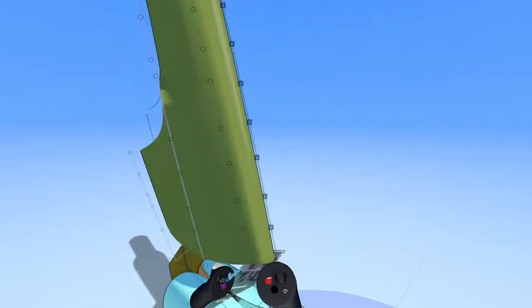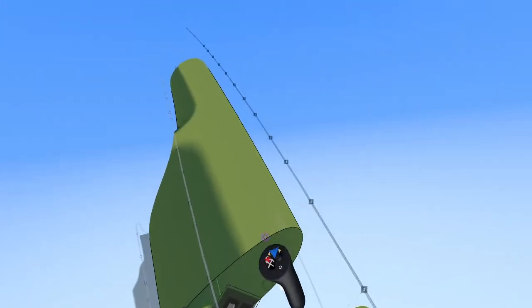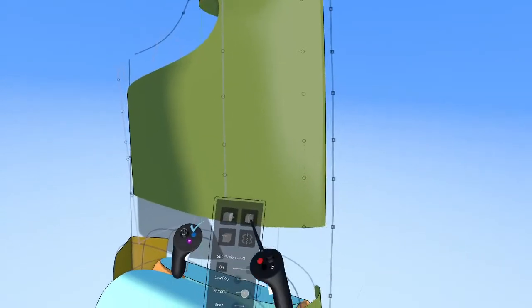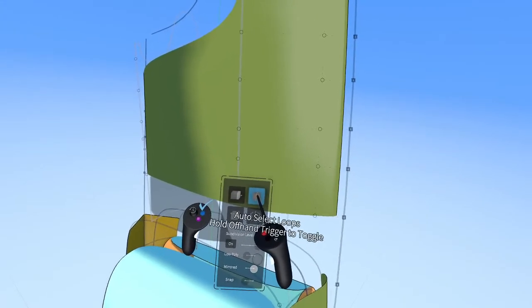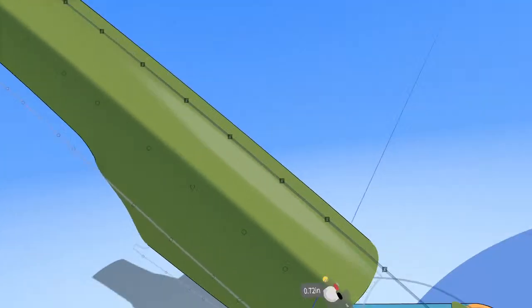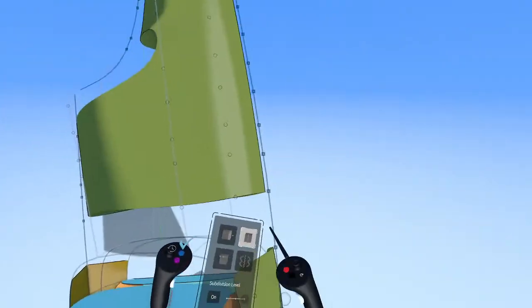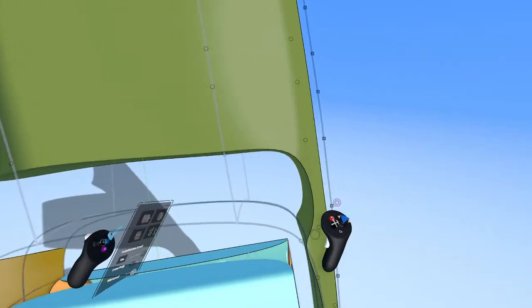Okay, so what I'm noticing here is I want some more shape here. It's curving in, but I want a little more of a radius over here. So I can click and add an entire row of edge loops, and then I can shift that row out by turning on this option here on my edit panel, auto select loops. Once I turn on auto select loops, I can grab the entire row and shift that out. I can do the same thing down here and then turn that option off so that I'm not grabbing an entire row again.